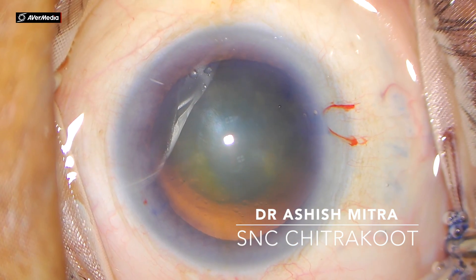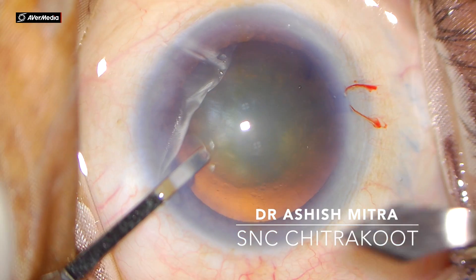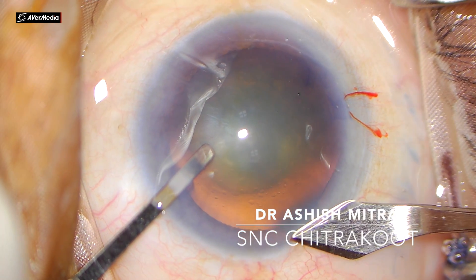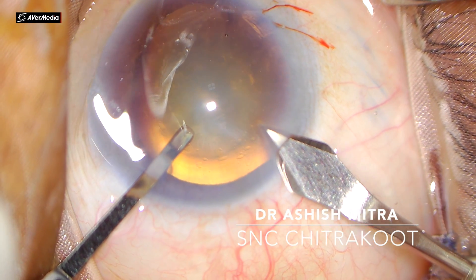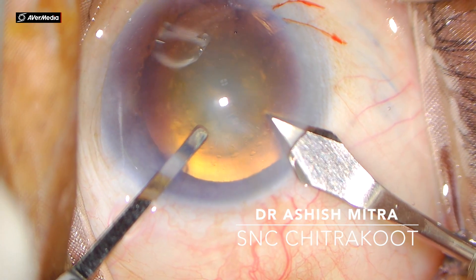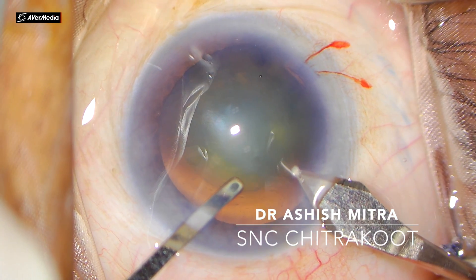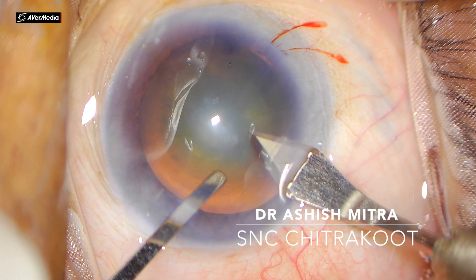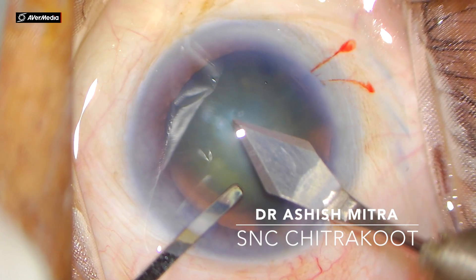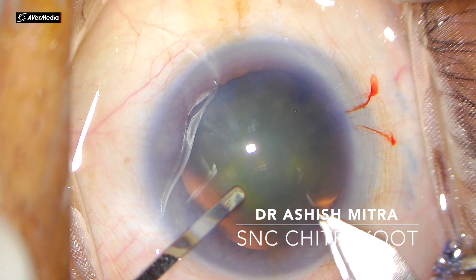Initially I make a groove — it's a triplanar incision. Then I enter into the cornea about 1.5 millimeters and dimple down, and my entry is parallel to the iris plane. You can move in slowly as I demonstrate in this video.